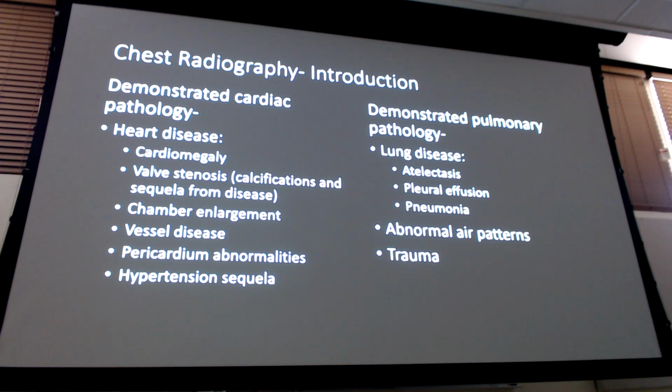Sequela from hypertension. Anybody know what they think would be a concern for long-standing untreated hypertension? What that would do to why we get a chest X-ray? So maybe pulmonary hypertension, but let's say it's not pulmonary. Let's say it's just regular hypertension. Heart failure. We're going to talk about just heart failure. Left ventricular hypertrophy, right? From the heart working so hard for so long, it enlarges because it's a muscle, and you can see that on an X-ray. You can see that left ventricle being larger than it normally should be once you get used to seeing normals, right? We'll be able to see something.